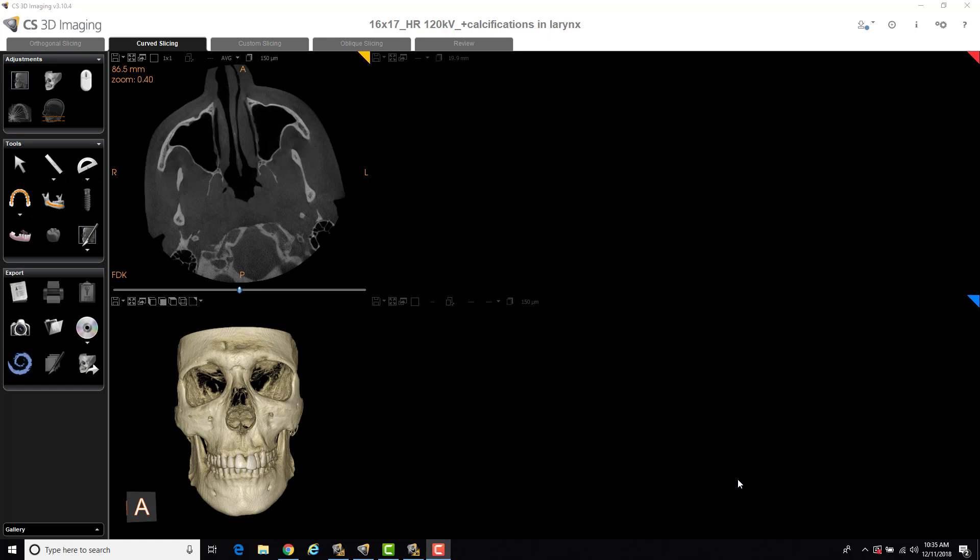Another application is you'll notice when the scan first opens, the axial slice here is actually kind of angled. The head was shifted to one side. So we could use the reformatting tool to recenter and realign the patient properly, so it'll look better and make it easier to use the software.